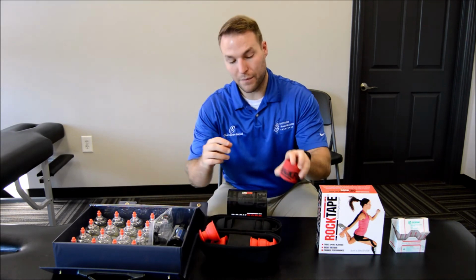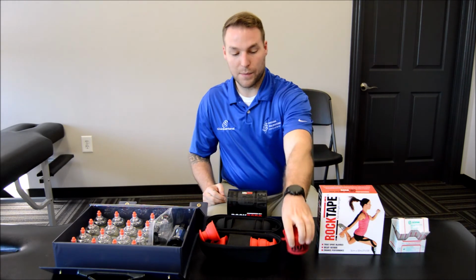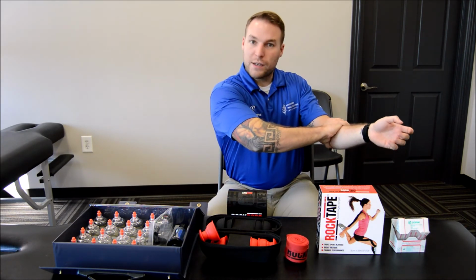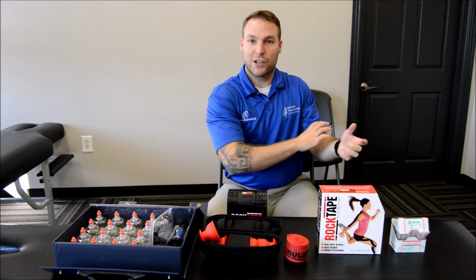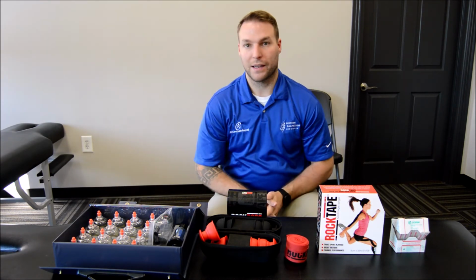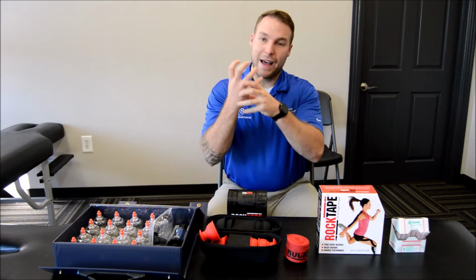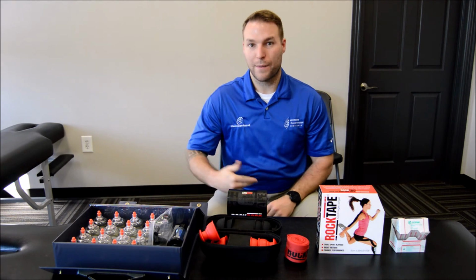We can do the same thing with these floss bands where we wrap an area of the body up. So I might wrap my forearm all the way up. It provides some good compression in that area, and I start to do muscle contraction and slide those tissues through there. This is really good for acute inflammatory conditions like ankle sprains, joint sprains. It really kind of squeezes all that fluid out of the area, so then you can provide some movement to that area and help rehab it a little quicker.